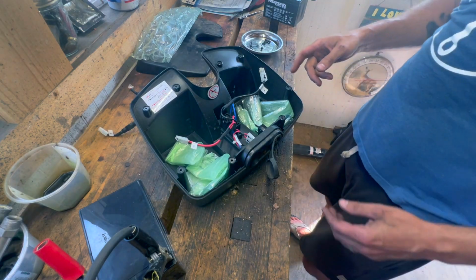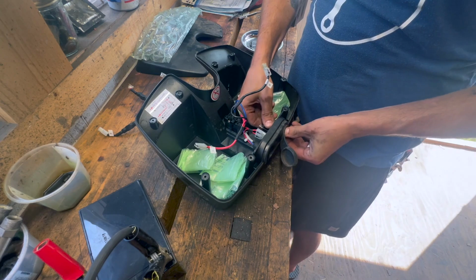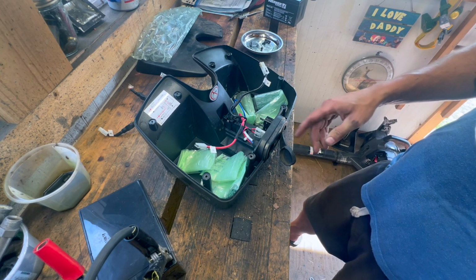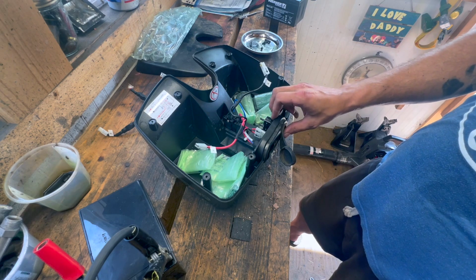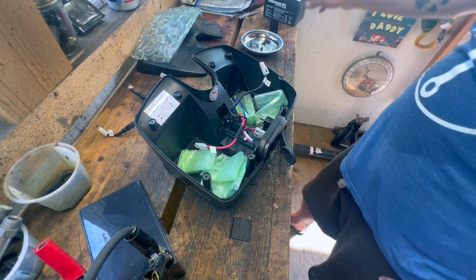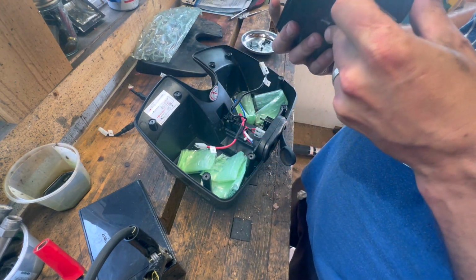If that's the case, if it was stuck in the open position, it should have been getting power to the batteries, although perhaps it doesn't even need this on or off to charge it. I'm not really sure. Like I said, there's no date code on these batteries, but I would assume that's probably our issue.